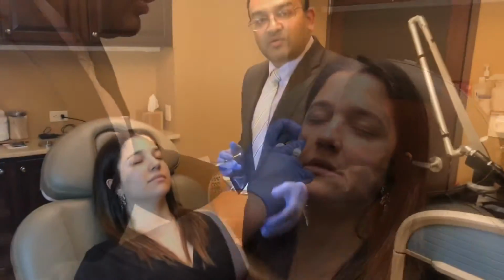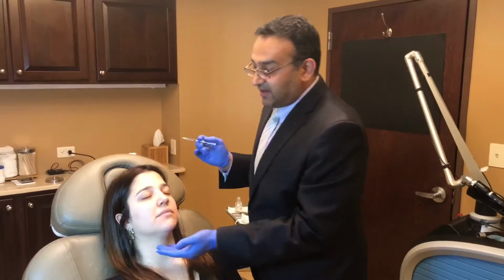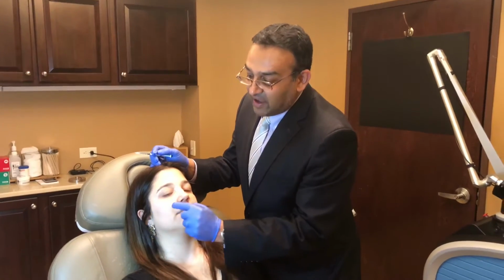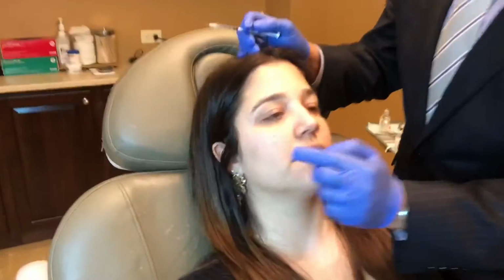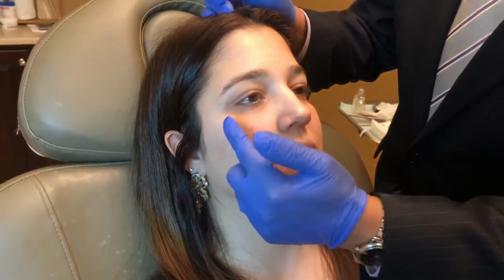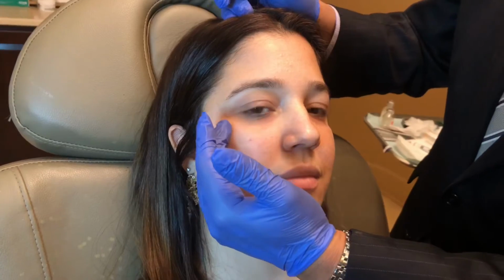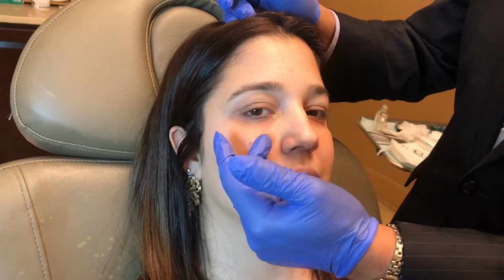We just finished up this eye, and as you can see, there is hardly any swelling. I went in through this one point over here, and you can see how this area, which was a little bit sunken before, has really filled out nicely, and it just opens up her eyes, gives her a certain brightness compared to this side, which you can see is a little bit flatter and it also looks a little bit darker. And the other thing I did was just enhance a little bit of the cheekbones just to give her that nice definition that extends.